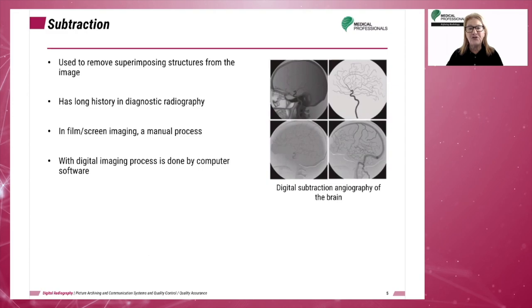Subtraction has a long history in radiography, specifically in angiography. The process was originally a manual process completed in the darkroom. Digital subtraction angiography, or DSA, was pioneered in the 1970s. Subtraction is particularly useful in studies using contrast media. The contrast medium filled structures can be enhanced while suppressing overlying anatomical structures.